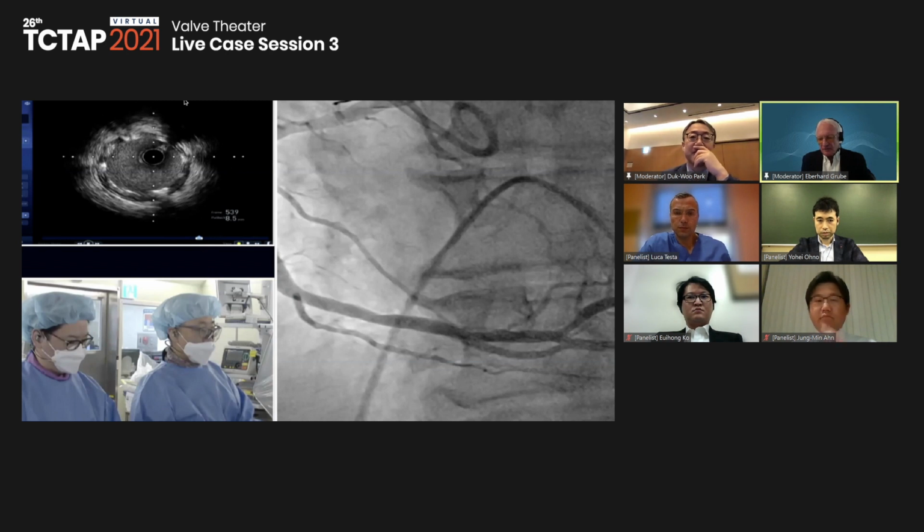Same session stenting of the right coronary seems to be not a high-risk PCI, so I think that's a very reasonable approach. Also, the sizing with 26 is a good one for the Sapien 3, with minimal to moderate calcium, so that shouldn't be any problem.